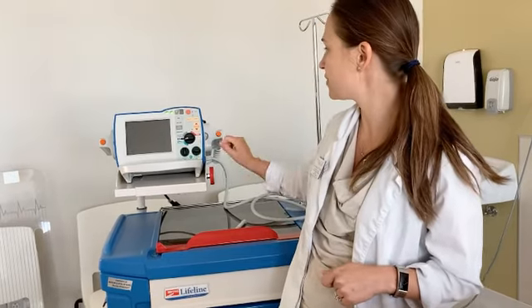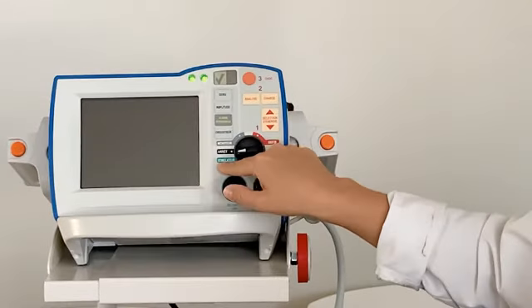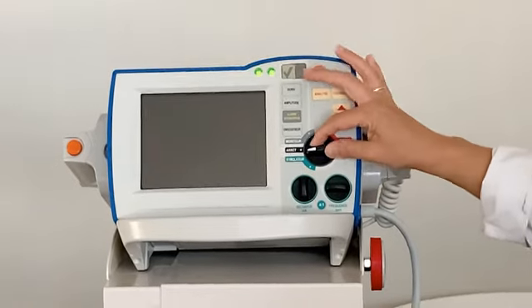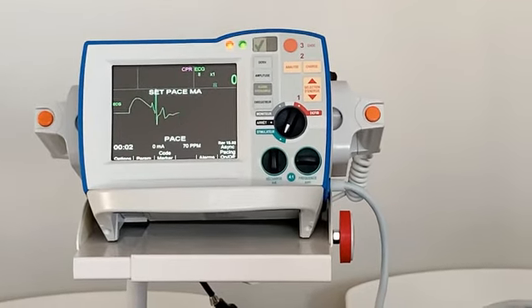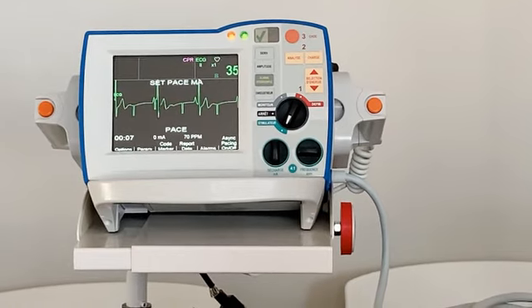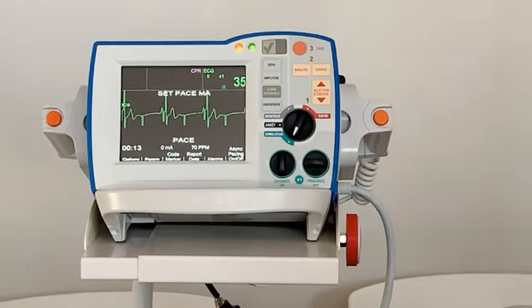So in this case, instead of turning the knob to defibrillation, I'm going to turn it onto stimulateur in French, or pacing in English, depending on which kind of defibrillator you have. Now I'm capturing the patient's electrocardiogram, and the patient's heart rate is 35.